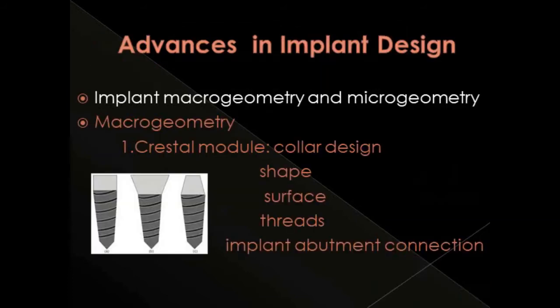Next is the advances in implant design. So here we shall be discussing the advances under implant macro geometry and implant micro geometry, and I'll be mentioning the main contents under macrogeometry.